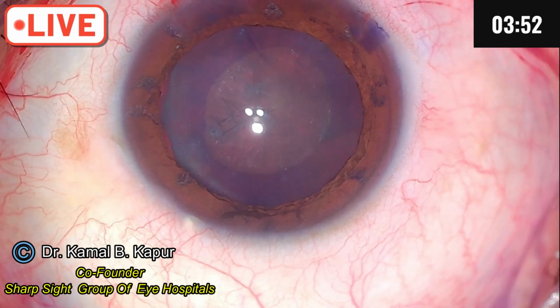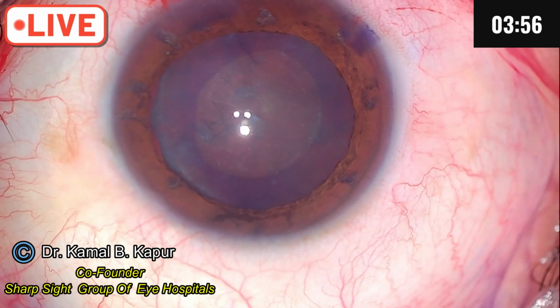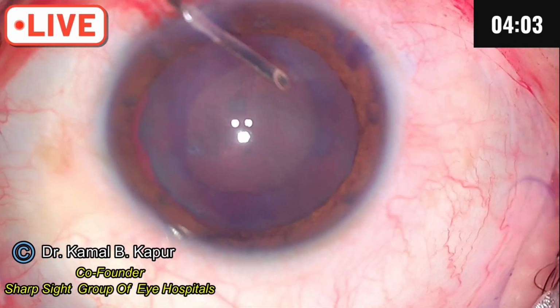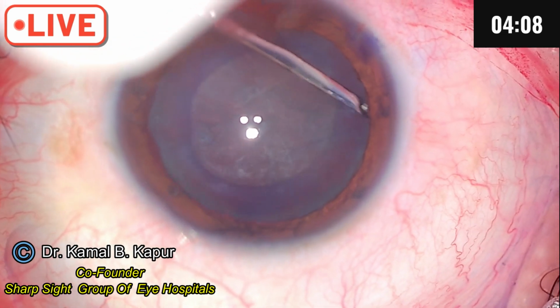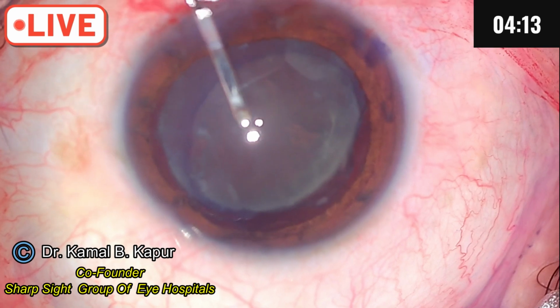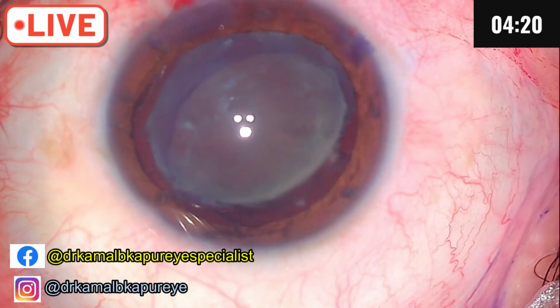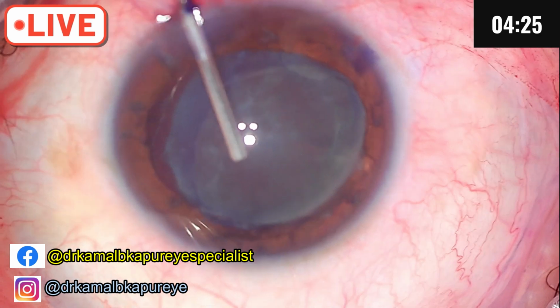There. Now the trick is not to do a very aggressive hydrodissection, but yet be able to complete the cleavage of the zone between the cataract. So yeah, this is exactly what I was looking for. If I could deliver the cataract out of the bag in one go.